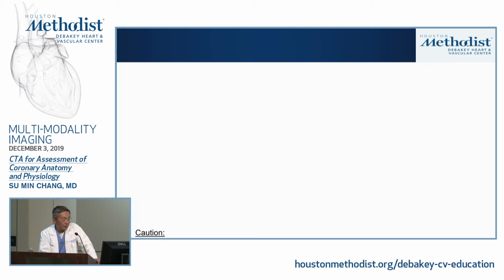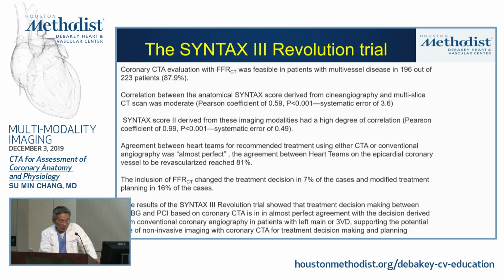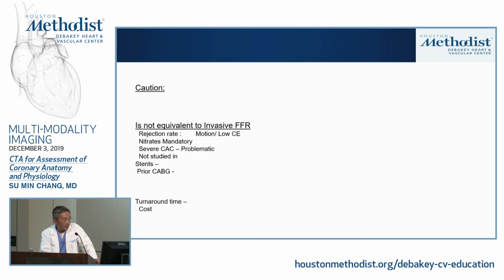But the point is, what's the caution, okay? Again, CT-derived FFR is not the same as invasive FFR, okay? The rejection rate across the board is about 20%.